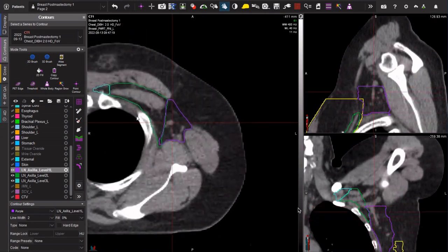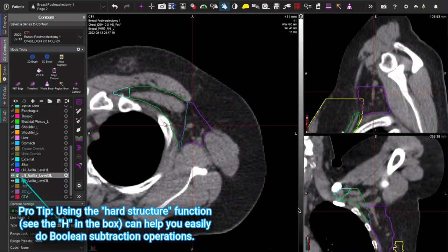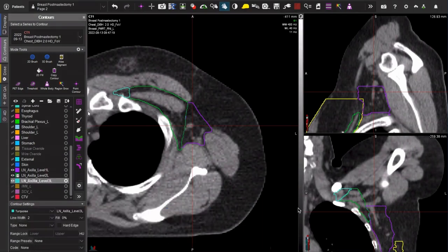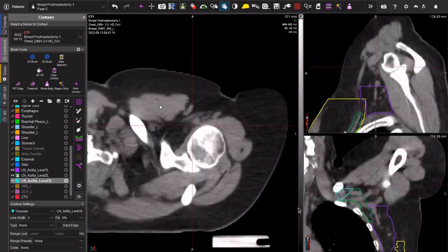To make everything look a little bit extra neater, I'm going to make level 2 a hard structure and just do a shortcut Boolean operation to subtract levels 3 and level 1 from the hard structure. Now I have this beautiful looking levels 1, 2, and 3.